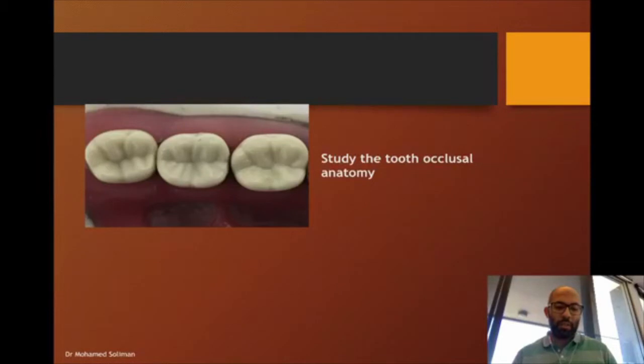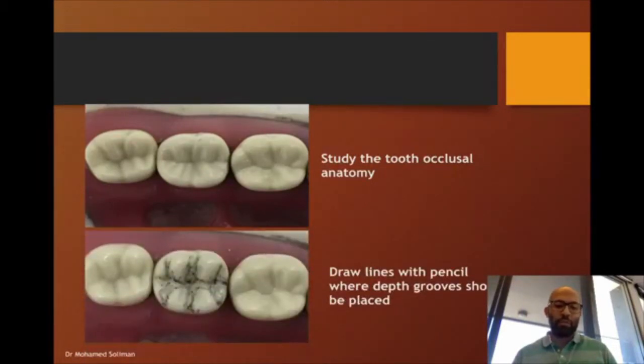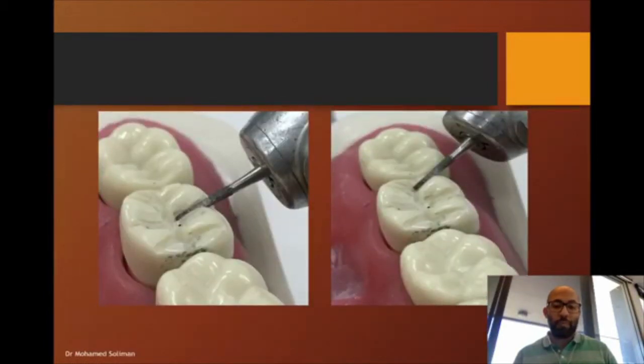When I was a beginner in doing crown prep, I was drawing lines in the grooves before I did the depth grooves. I usually use depth grooves when I do my preparation. Drawing a line with a pencil in the exam is actually acceptable, and you can use it to mark the grooves, and then you can do the depth grooves with the burr. When you align the burr, it is important to put it in the right direction of each groove, and then after doing the depth grooves, you will be able to connect these grooves together. Don't forget to put a groove in the central groove as well, because if you don't, it will be under-prepared.